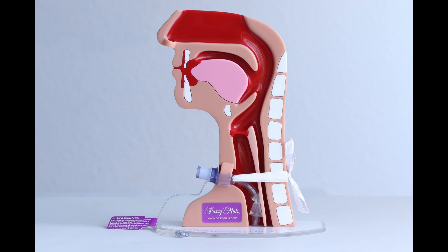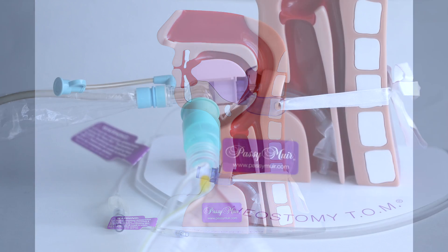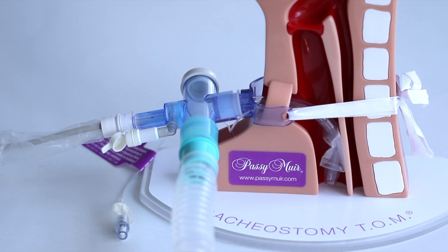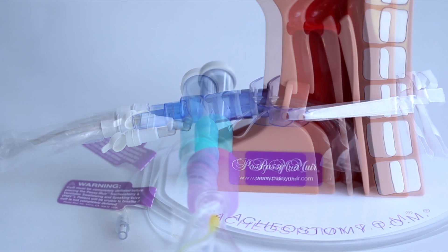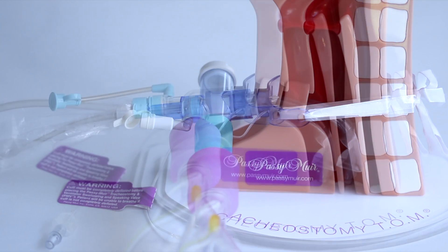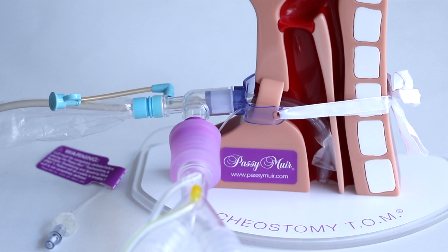The Passy Muir valve was invented by a patient for patients who require mechanical ventilation. The Passy Muir valve and adapters were designed to easily be attached inline to ventilator tubing and other adapters, including inline suction catheters. The valve can also be placed in ventilator tubing and attached directly to the 15mm hub of the tracheostomy tube.